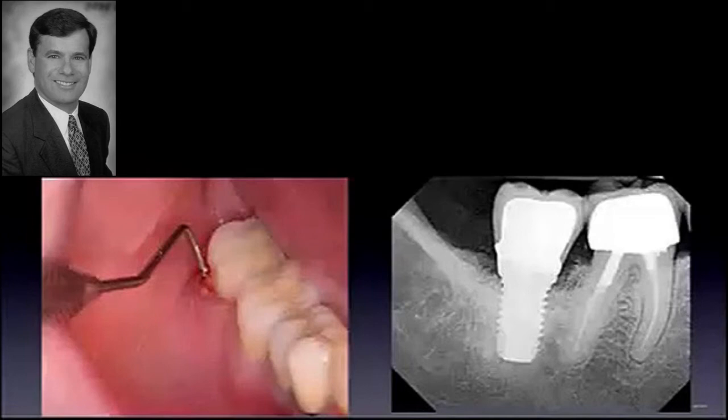But you know, the thing about a periodontal lesion, we typically can do something about it. But we have a very difficult time dealing with chronic lesions that are related to design. You know, the microgap. And the microgap being a leaking entity with chronic inflammation associated with it can be a long-term, decades-long problem. Yet, it still may result in an acceptable implant to the patient, an acceptable outcome to the patient, stability, and achieving its original goal of replacing a tooth.